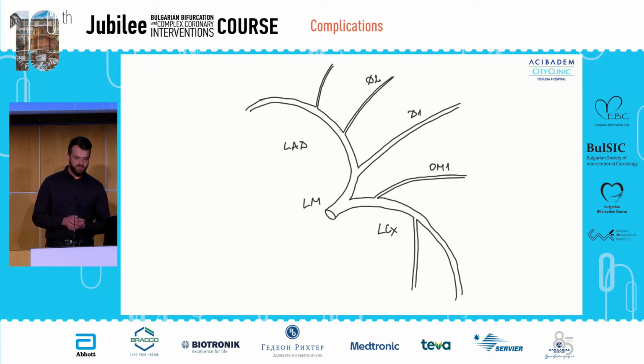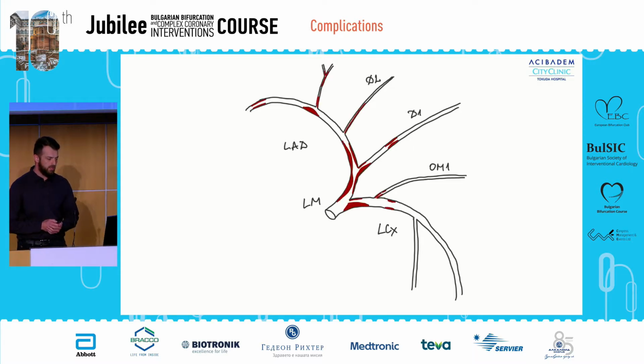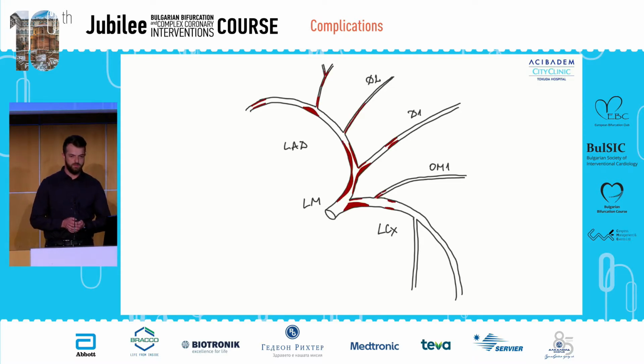We can summarize the anatomy on the left as the following. As you saw, there is a tight ostial lesion of the left circumflex, a small marginal branch with ostial lesion, one early big diagonal branch with severe ostial and proximal lesion, lesions of the LAD in proximal and mid segments, and diffusely diseased second and third diagonal branches.